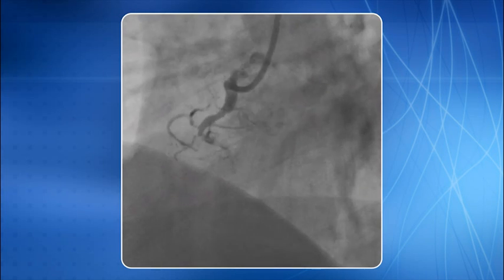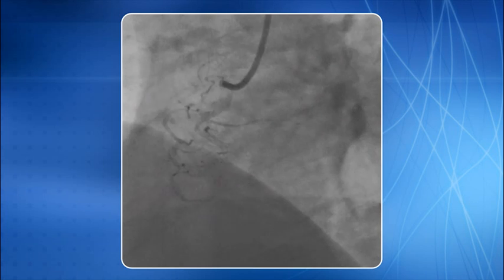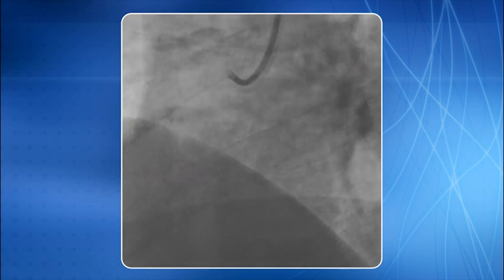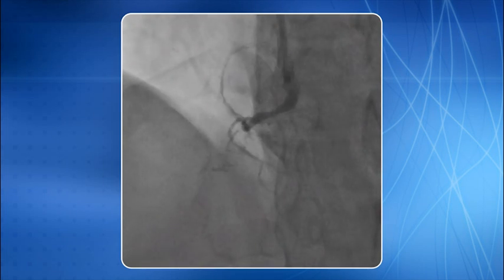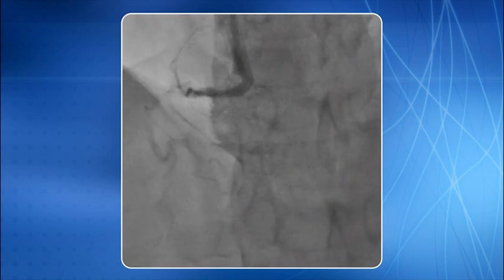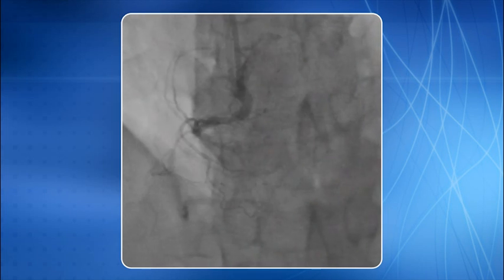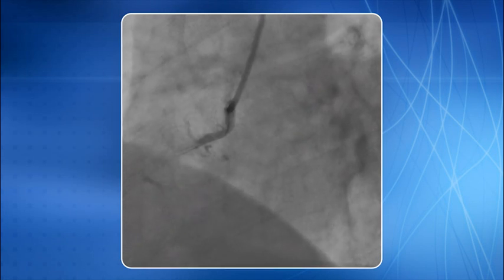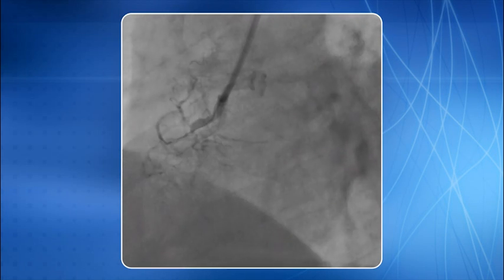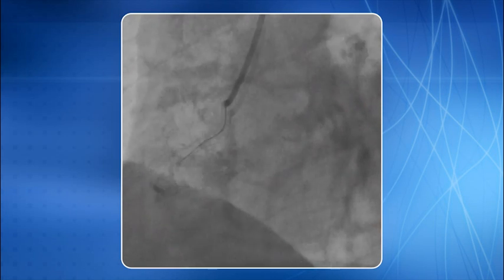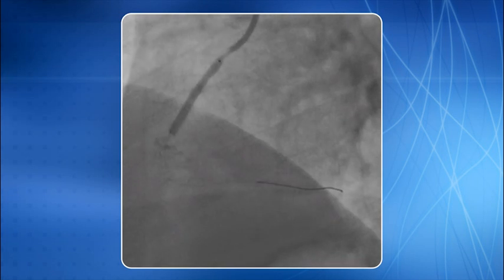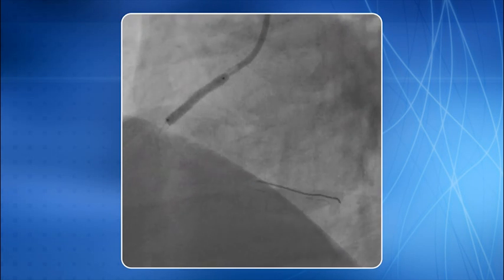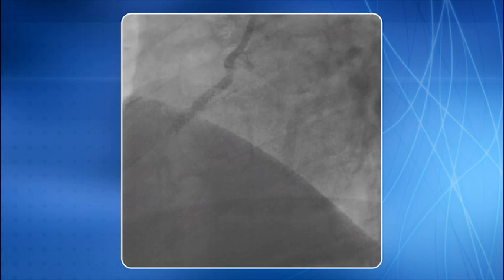This is an example of an anomalous right coronary artery arising quite anteriorly from the right coronary cusp. The RCA is totally occluded in the mid part. Intervention is in progress, the stent is deployed, and the final result is revealed.